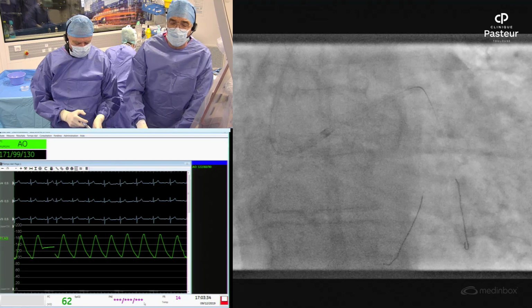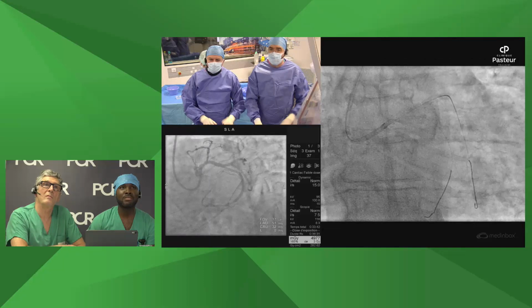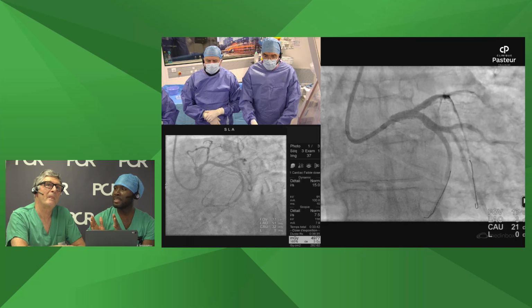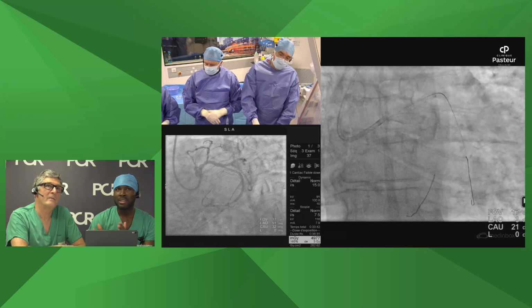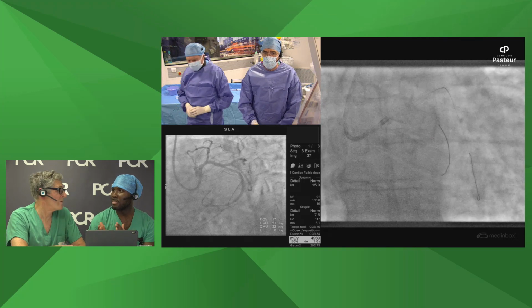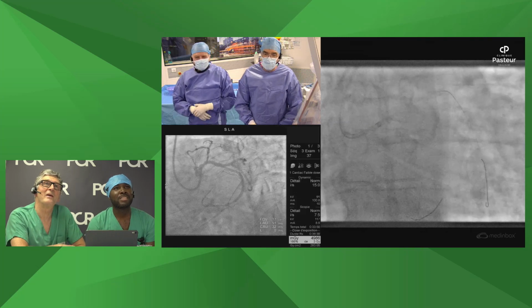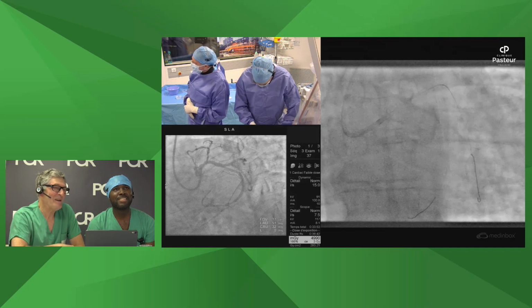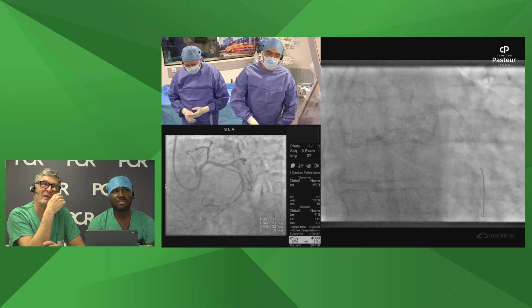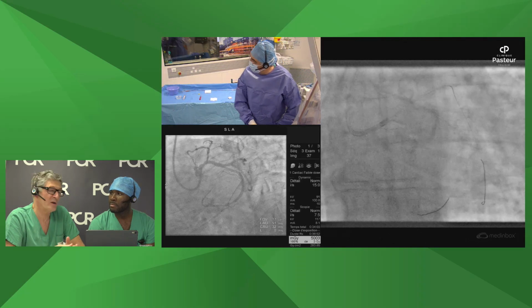Okay, we go. A question to my senior. Now the 5. What do you think about another technique, the POT-side-POT? That's an important point. I think you do this or the kissing. So Jean, do you want to answer this question? It's a very important question. During this time, we prepare the 5 millimeter balloon. POT-side-POT is a very nice alternative to final inflation.